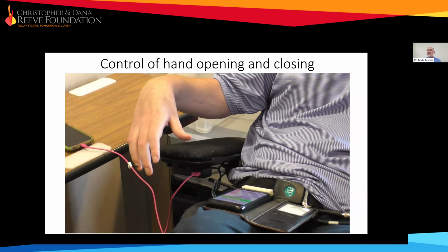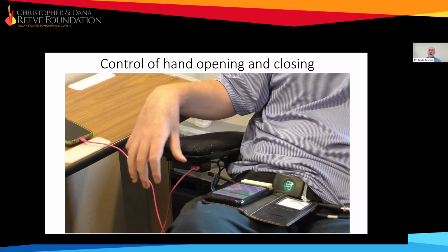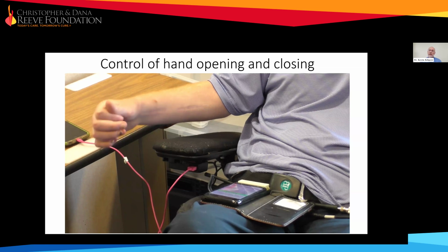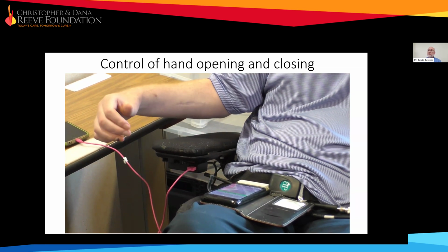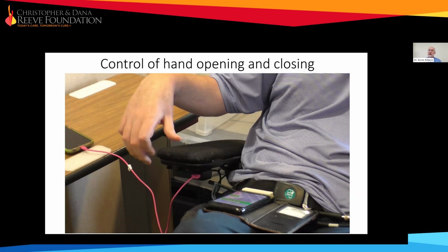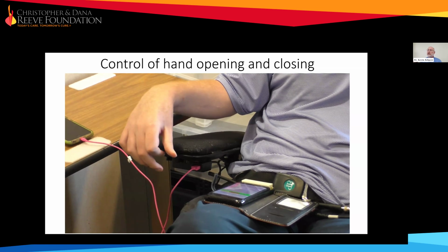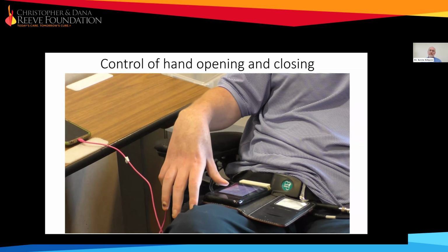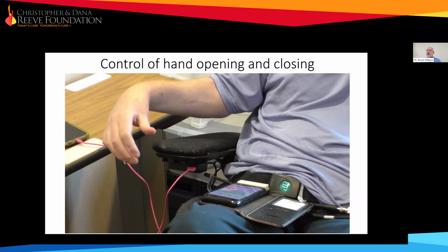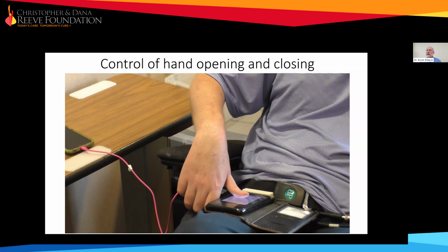Or walking function or whatever it might be. So in my view, starting around 6 months after a person has been injured, through the first couple years, I think that is a good time to get evaluated for these systems, to really understand the kinds of function that you might be able to gain and see if it's the right thing for you. But really, if someone is sitting out there who's been injured for 10 years, there's no reason not to come in, be evaluated, and see if maybe this might be of benefit.